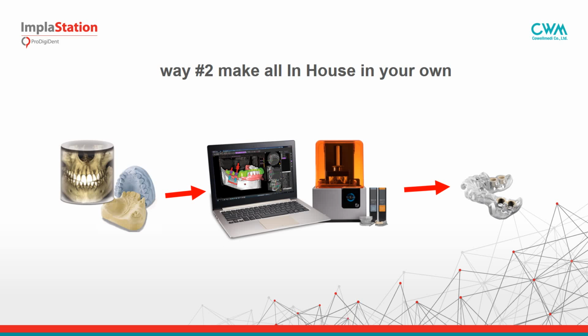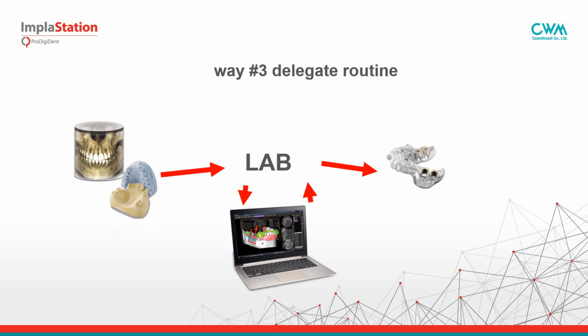Now it's quite cheap and easy to use, and you can do all steps from planning till printing by yourself. And the third one is like a mix of the first two. You can delegate some routine steps to the laboratory to save your time, and delegate some complicated steps to the professionals, and this way is quite in demand.